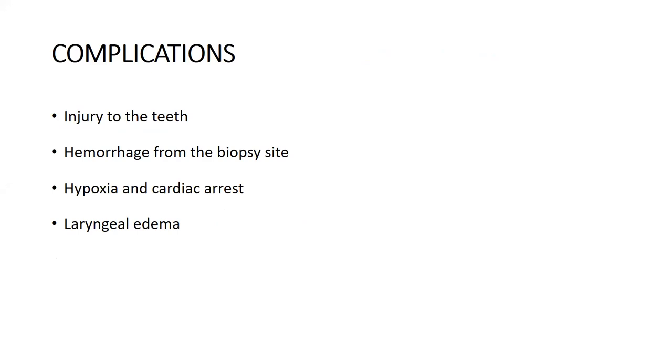So the possible complications of rigid bronchoscopy are injury to the teeth, hemorrhage after taking a biopsy from the suspicious site, hypoxia and cardiac arrest, and laryngeal edema.